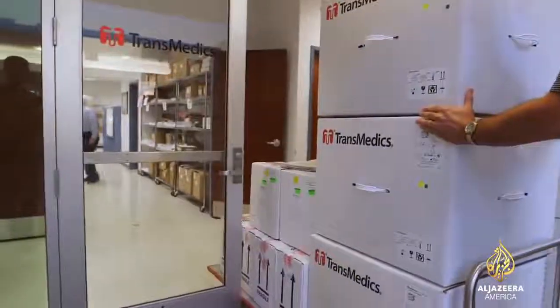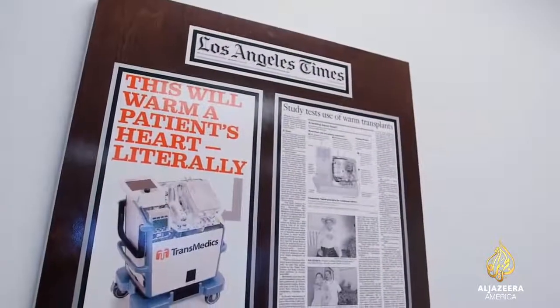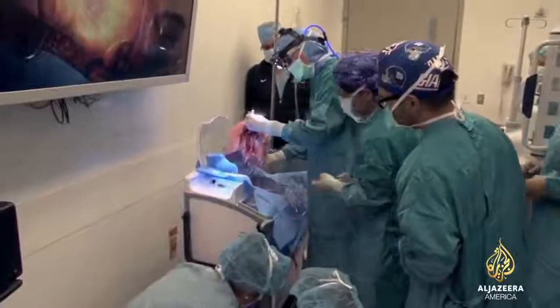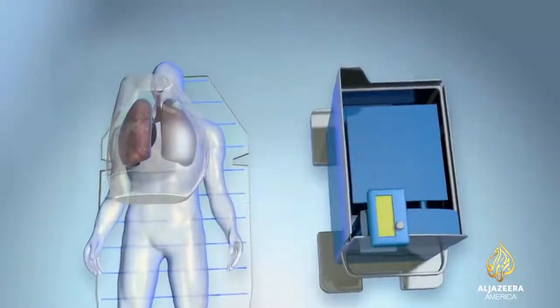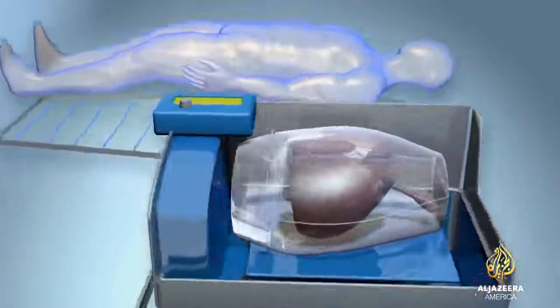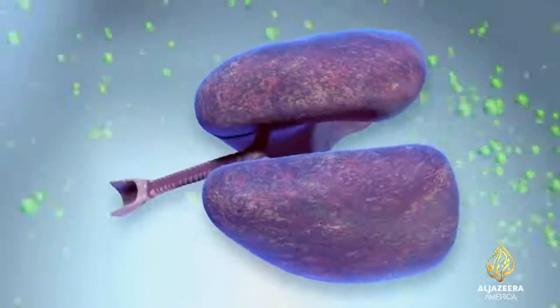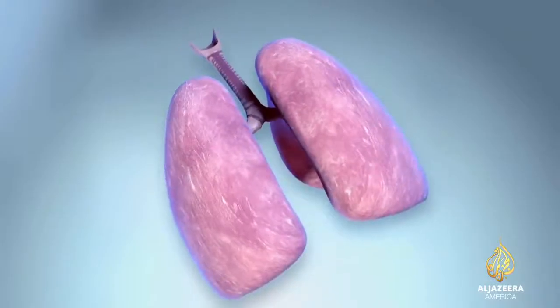Not content with just finding the perfect way to transport organs, Transmedics is also partnering up with research centers on testing cutting-edge therapies with their device. We can take a lung out of a patient suffering from severe pneumonia, put it in an organ care system for a few hours, and subject the lung to a significant level of antibiotics that we cannot give to the patient because we become toxic. Flush the toxic antibiotics out and then retransplant the lung back. And we are sure that some of this will come to fruition over the next 5 or 6 years.